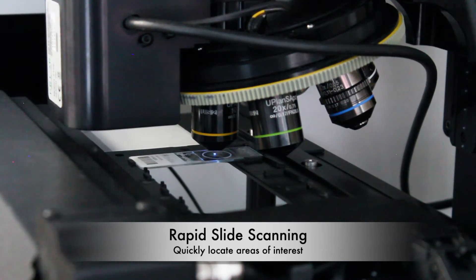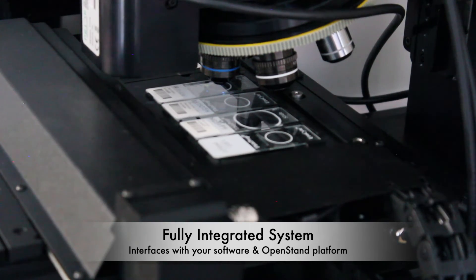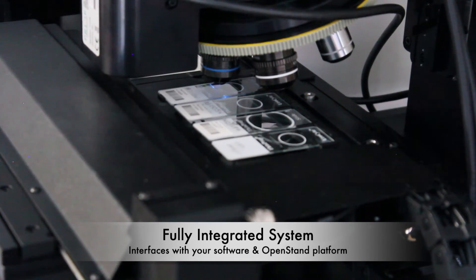Prior's high-speed stages allow for fast scanning of up to four slides at a time. Its open-system architecture allows you to use a wide variety of microscopes and optics, or use Prior's OpenStand platform.